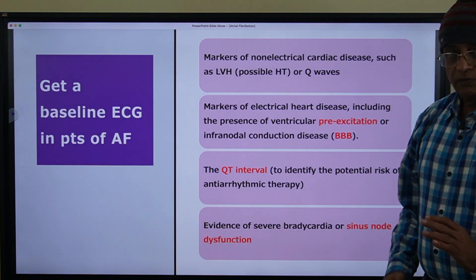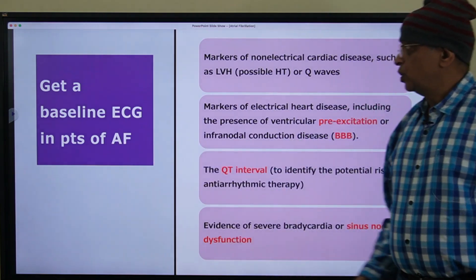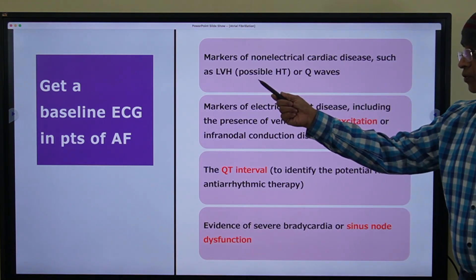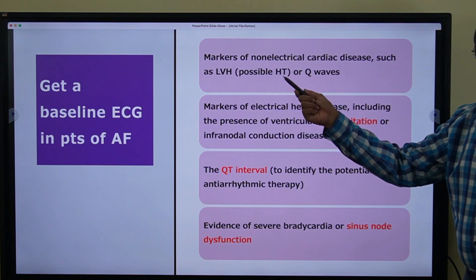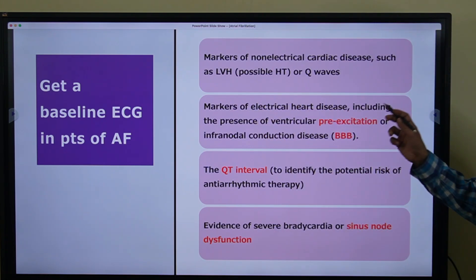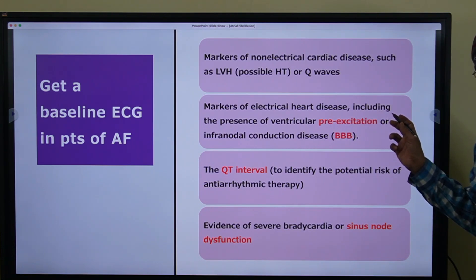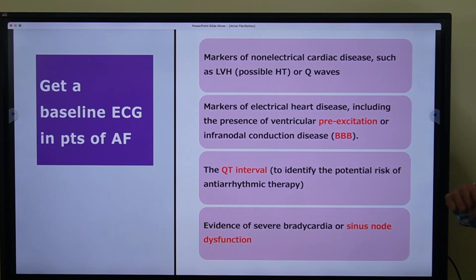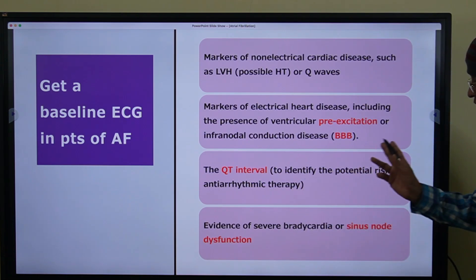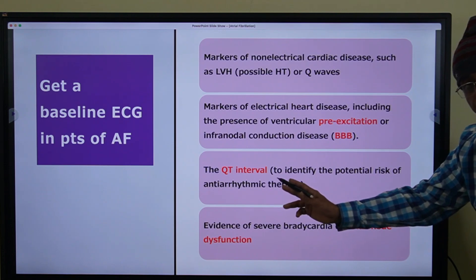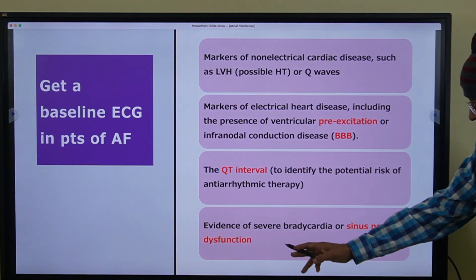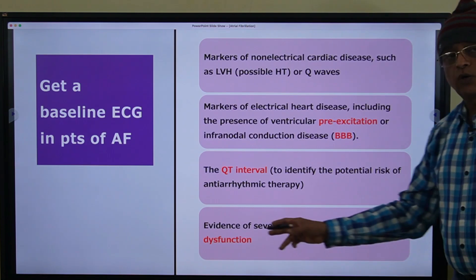Always get a baseline ECG when an AF patient presents. The ECG can show markers of non-electrical cardiac disease such as left ventricular hypertrophy pointing to hypertension, or Q waves suggestive of old myocardial infarction. Also look for markers of electrical heart disease: pre-excitation — if present, avoid drugs that slow AV conduction — and bundle branch blocks. Check the QT interval to identify potential risk from anti-arrhythmic therapy, as many such drugs increase QT and carry risk of torsades. Also rule out sinus node dysfunction if severe bradycardia is present.